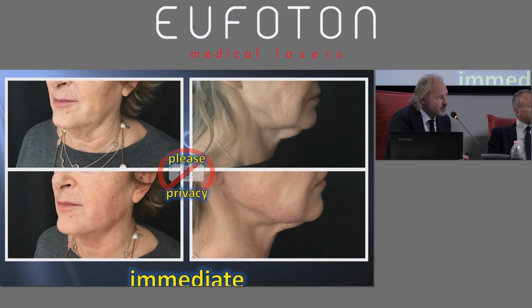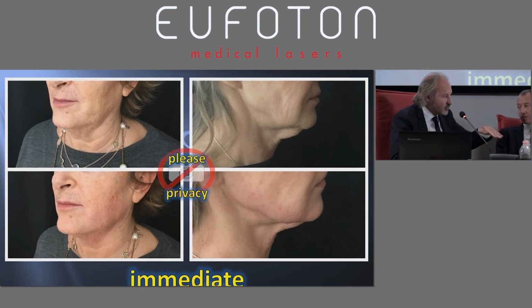I'm doing this above all for those regions that are very fatty, with a lot of fat. The only area where I pinch the tissue and go downwards with the cannula is the submental area. I pick up the fold and then clamp different thicknesses. In that case, yes, I go and look for different planes.